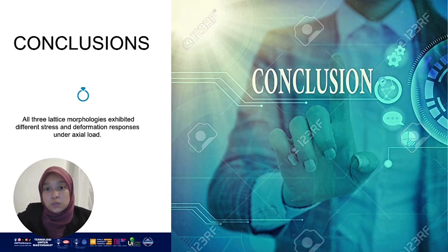Cages with about 70% porosity, gyroid-like design and a rough surface give the best result for bone growth without losing strength. Future research should include tests in living tissue and explore special surface coatings to improve bone bonding.